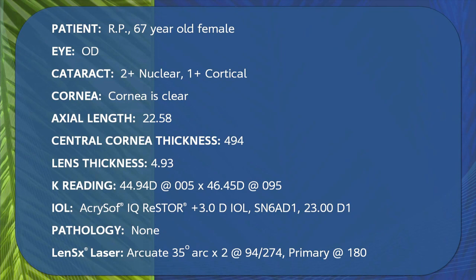This is his patient, a 67-year-old female. She has a cataract. Look at her case — she does have some cylinder. Steve's planning two arcuate incisions with the LensX. He'll be using a Restore with the Monarch 3 injector. The patient's left eye was done a week ago by Dr. Sione and has a Restore lens, and she's very excited about having the second eye done.